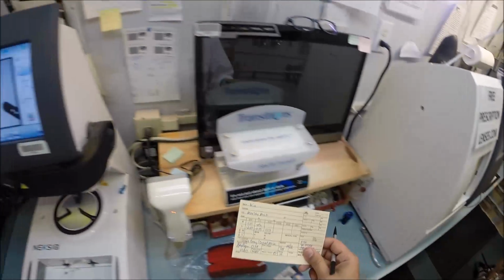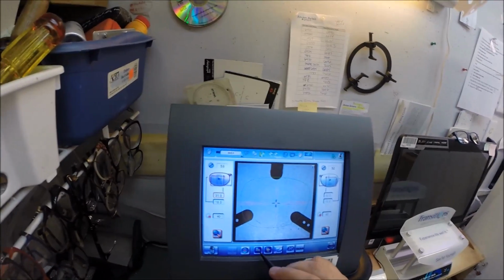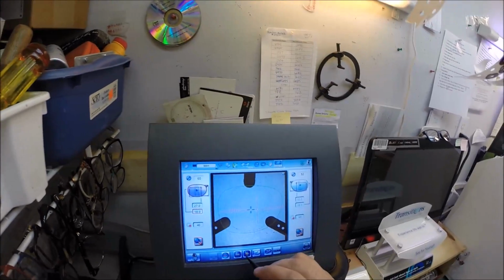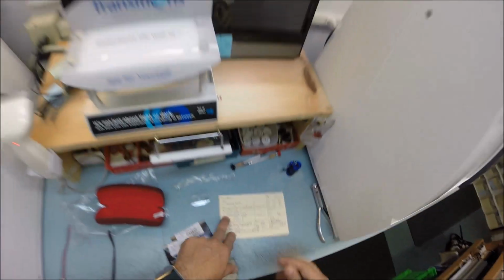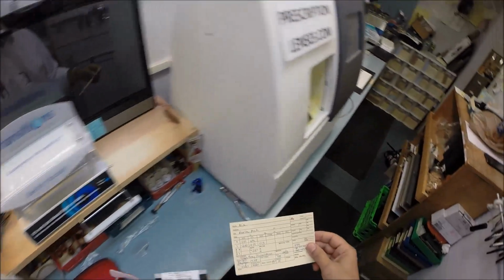Your pupillary distance for each eye is 27. Starting at 32, we will go tap the minus button until we go down to 27. Let's go ahead and raise the optical center height up to 20. In fact, let me write that down. 20. Or is that 25? You know, I didn't know there was going to be so much math with this. All right, so let's come down here and get your lenses prepped.